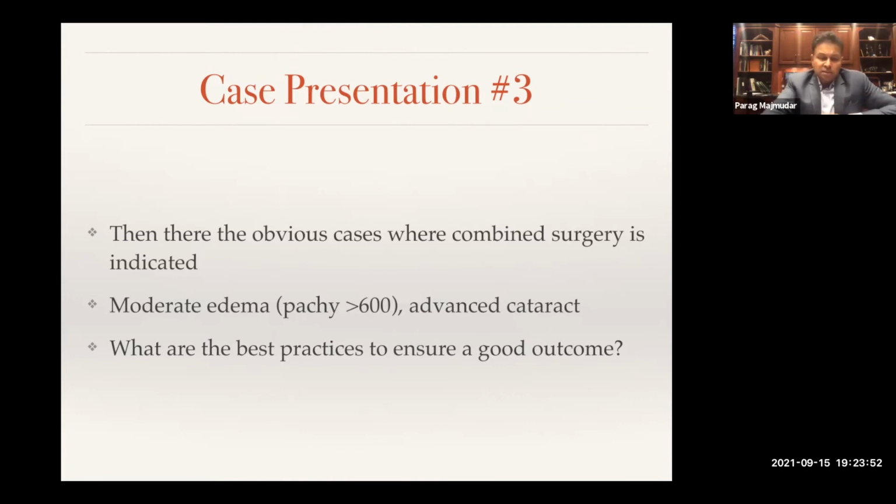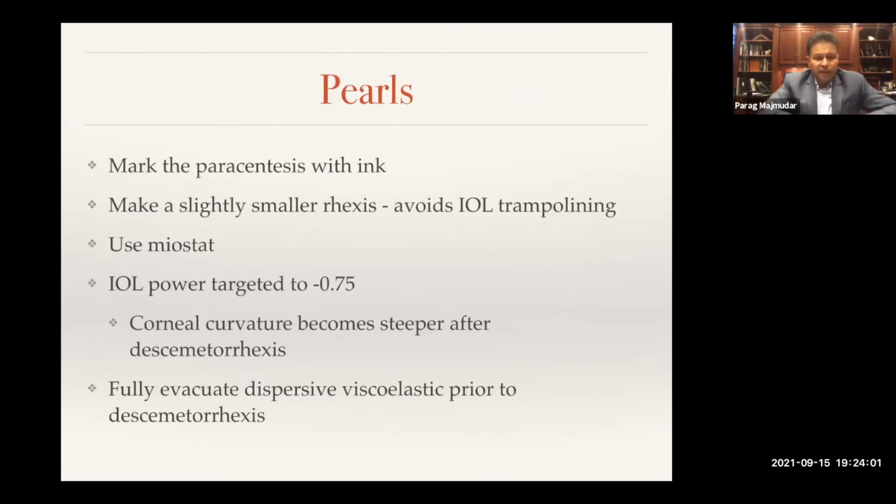Now, if we decide that this is the best thing for the patient, there are a few things that I think we can do to help make sure that we can get good results. And I'm going to just kind of talk about a few of these. And then in the last probably 15 minutes that we have or so, I'm going to go through this surgical case that I had. And I'm going to show you some areas where I try to focus on things, as far as the DMEK as well. Pearls just for DMEK in case anybody out there is starting out in their DMEK career as well. So we can use this time to discuss that. And then afterwards, we'll be happy to open up for questions based on any of the stuff that I've talked about or any of the stuff that you have questions on in corneal surgery.